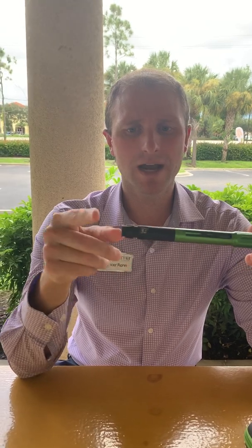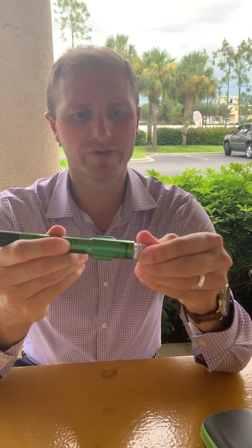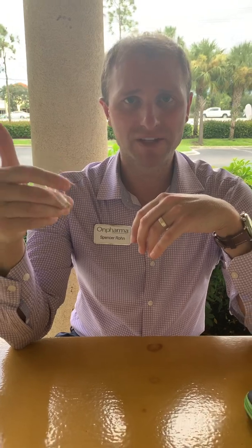So once you dial it to 9, you push this button in, and what that essentially does is it injects sodium bicarbonate into the local anesthetic. Now all you do is reverse the steps: pull out, twist, and set that mixing pen chairside. You take your carpule of local anesthetic, and the assistant, hygienist, or doctor gets the syringe set up, puts this in the syringe, and the doctor gives the injection like he or she normally does. It's important to note that nothing with your technique is changing.